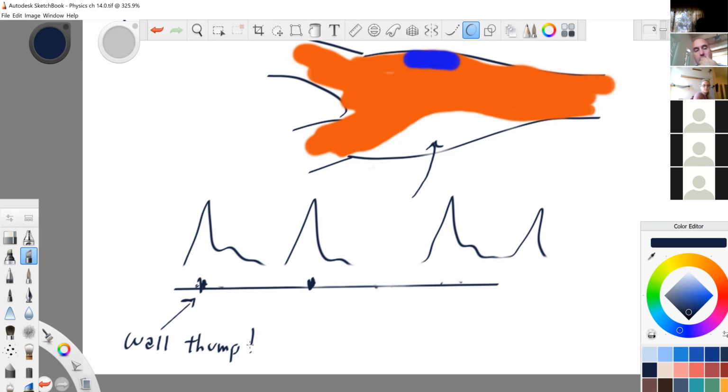That's fine. But if this wall thump becomes really noticeable, oh, and by the way, our velocity scale, let's say, is 0 to 300, and this is a carotid. So now we have increased velocities plus a more significant wall thump.